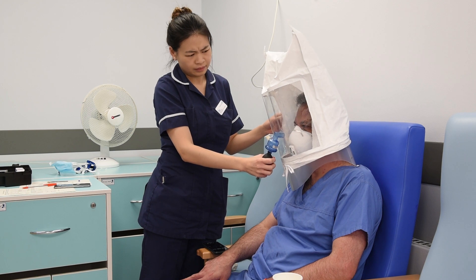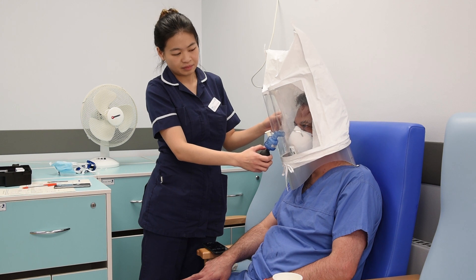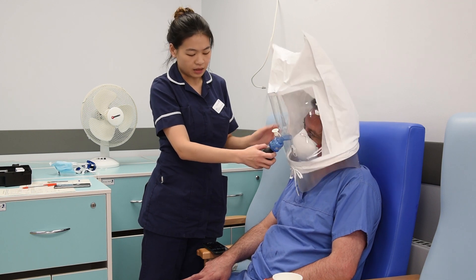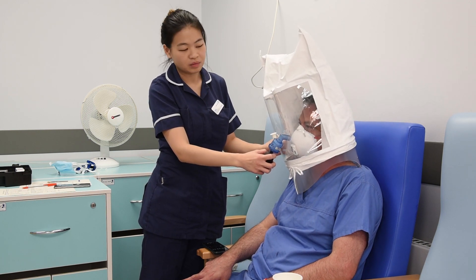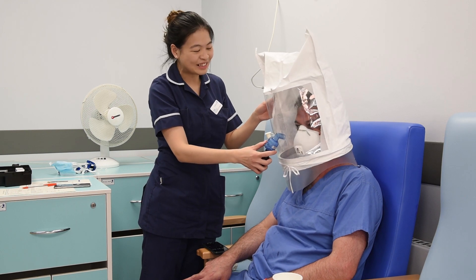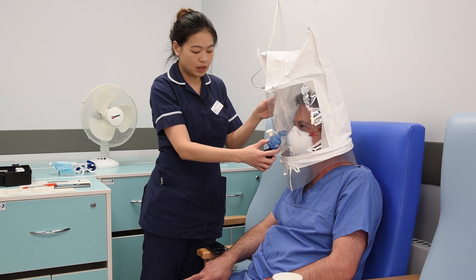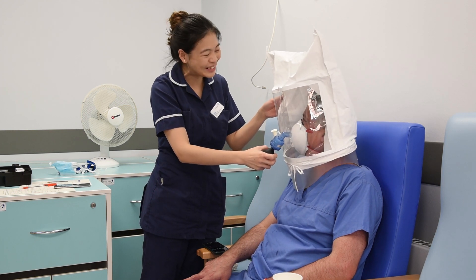I can taste it on my lips, but maybe that's from before — not on the breath. Turn your head side to side, left to right. Don't turn too quick — slowly, just left to right. Just keep doing it for a whole minute, slowly.